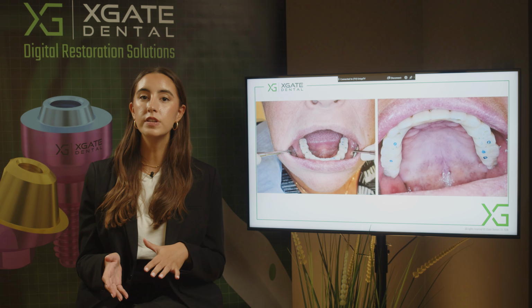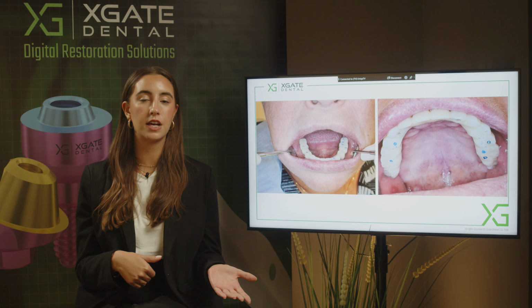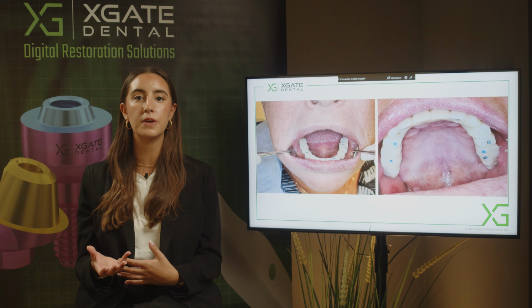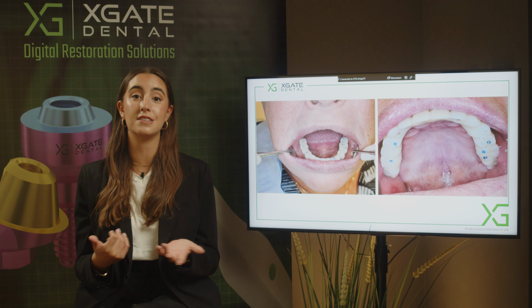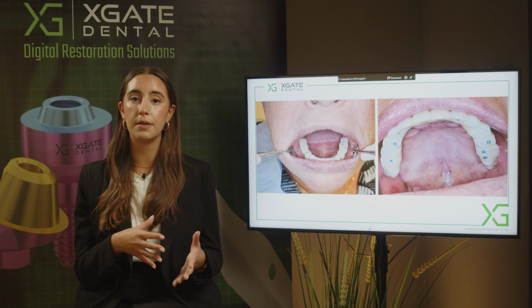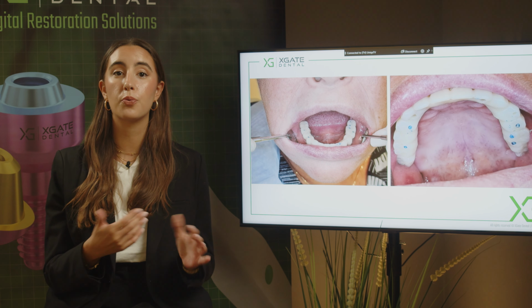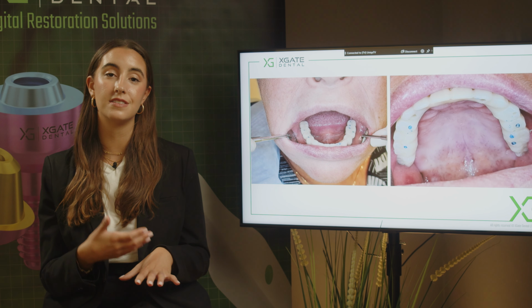Now, we can move the teeth into the buccal or make the teeth a little bit smaller. This depends on the patient's wishes and what we see in the mouth, because in the computer, you don't always see the same thing. We played with the anatomy a little bit. So every time we changed it, and when you mill in the bridge or print the provisional bridge, you already have this design in the computer.